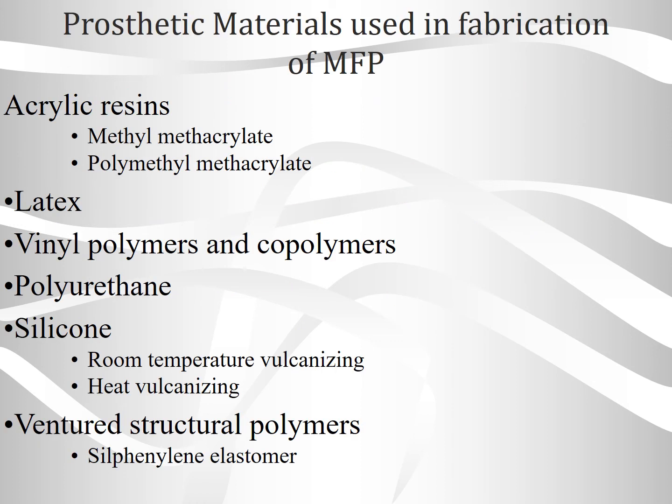Prosthetic materials used in fabrication of the M.F.P. These are acrylic resins, that is methyl methacrylate, polymethyl methacrylate. Then comes the latex. Then comes the vinyl polymers or copolymers.